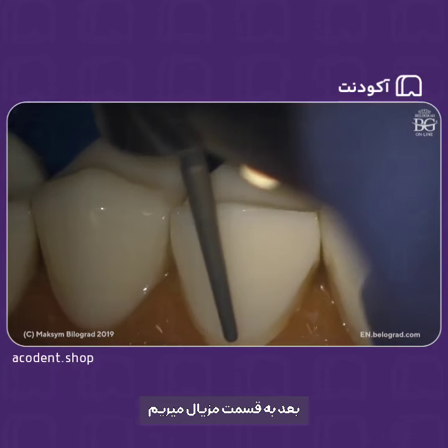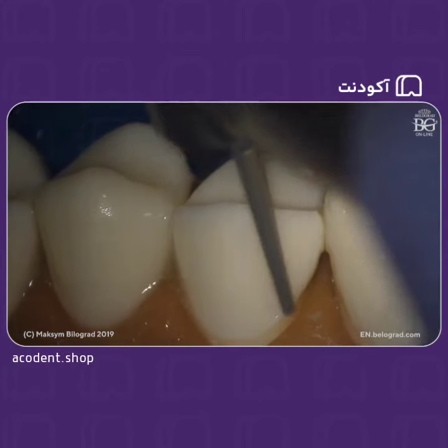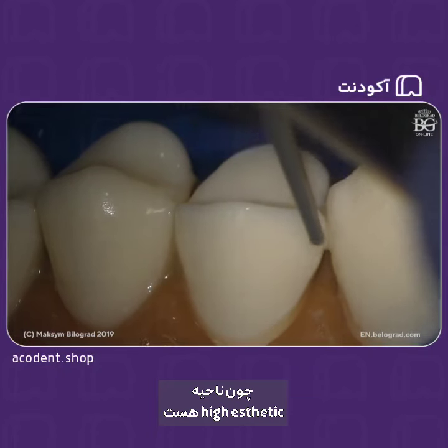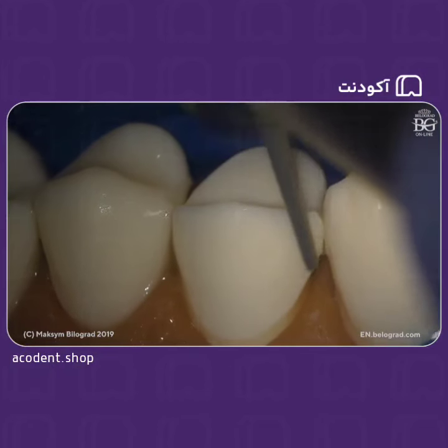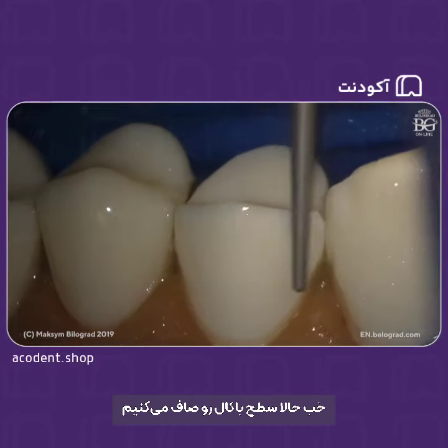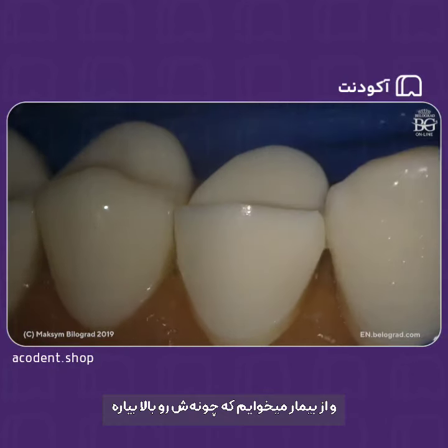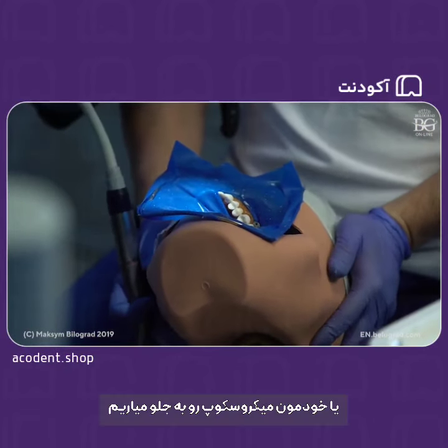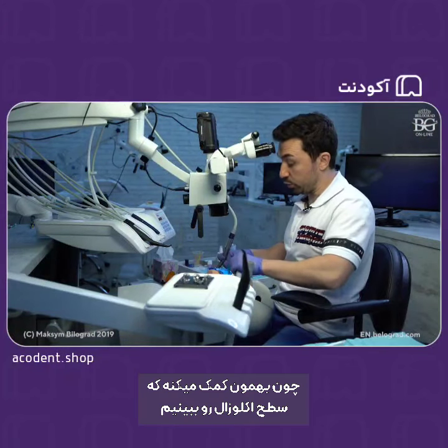Then we go to mesial, a little bit deeper mesially because it is a high aesthetic area. We don't want to get these transitions visible. Okay, now we will make this buccal surface also smooth. We will ask our patient to move chin up. Okay, or we will move our microscope forward also, because that will help us to see the occlusal surface.